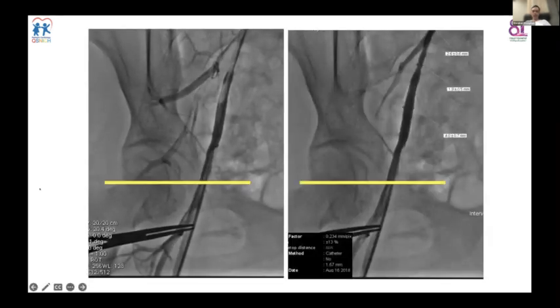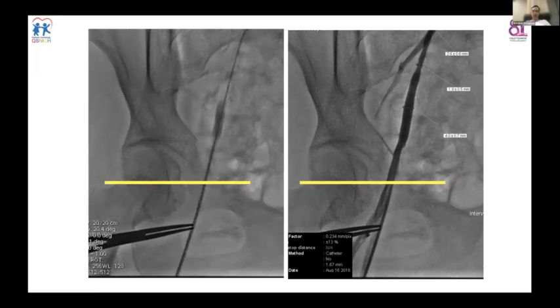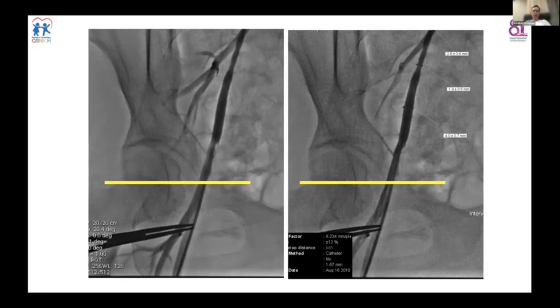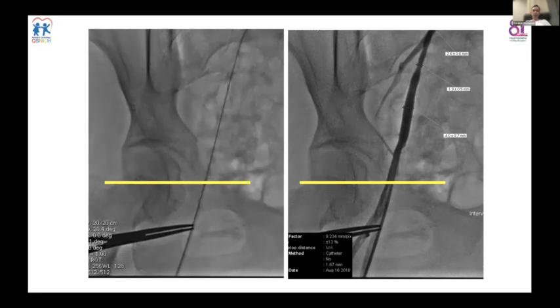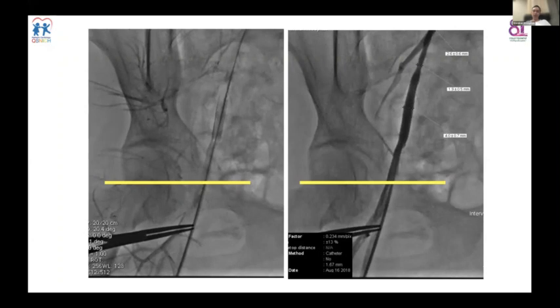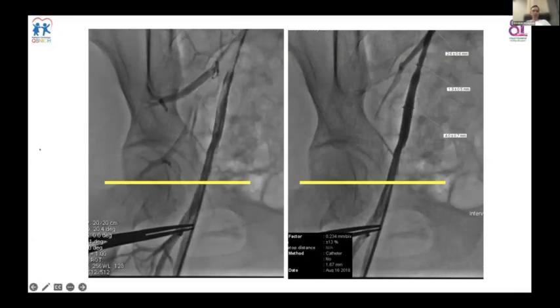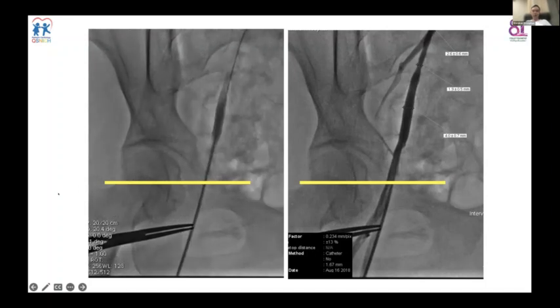Neeraj did mention this, but just to emphasize, starting with the puncture, you need to make sure that you have a good landing zone. In terms of the puncture, I personally use the anatomical landmarks. I use groin palpation, check ASIS, pubic symphysis, where the inguinal canal is, and then I confirm with ultrasound guidance.